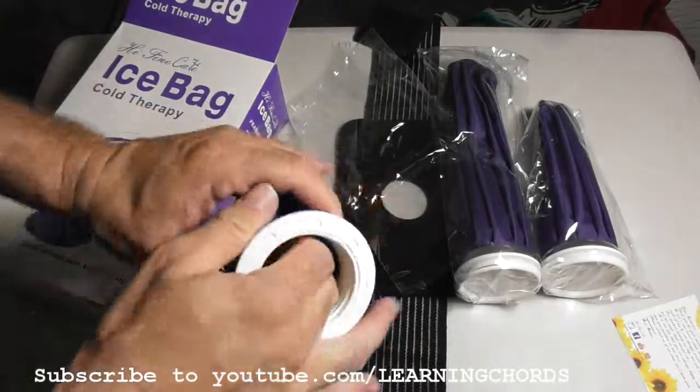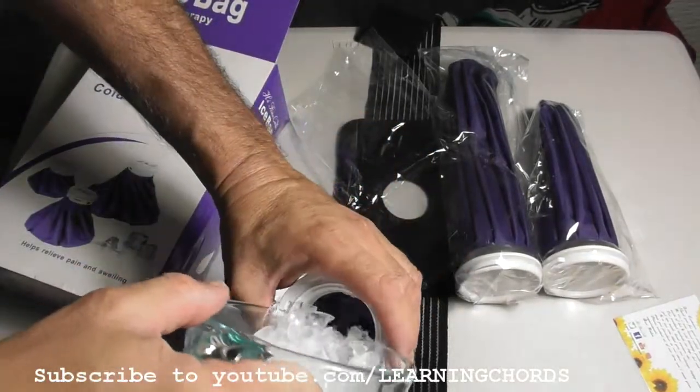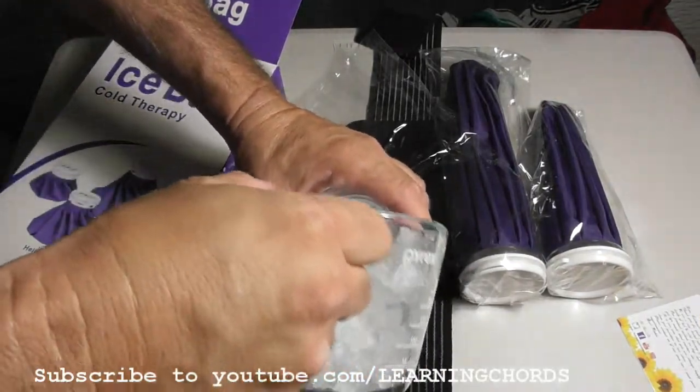So this is the 6 inch. When I use this thing, I like to use crushed ice. If you don't have crushed ice, that's fine — use cubed ice.